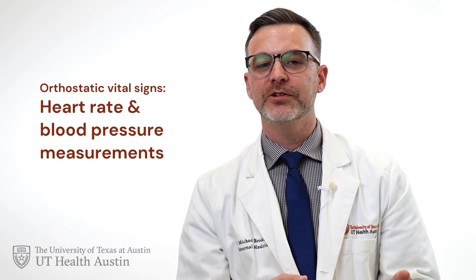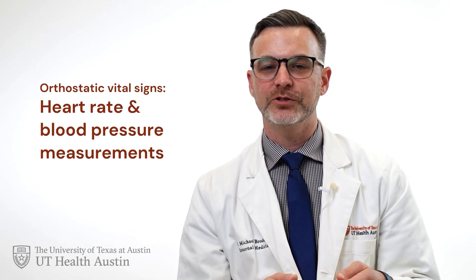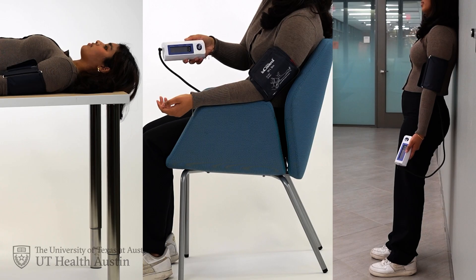Here, I'm going to show you how to measure your orthostatic vital signs, which is a series of heart rate and blood pressure measurements taken in different positions: laying down, sitting, and standing. Taking these measurements at home isn't an official way to diagnose POTS, but as a screening test, it can provide a lot of information to share with your doctor and help guide whether you need specific treatments or further testing.